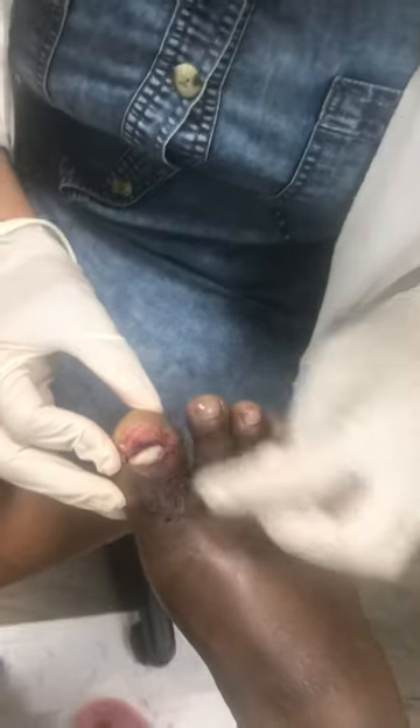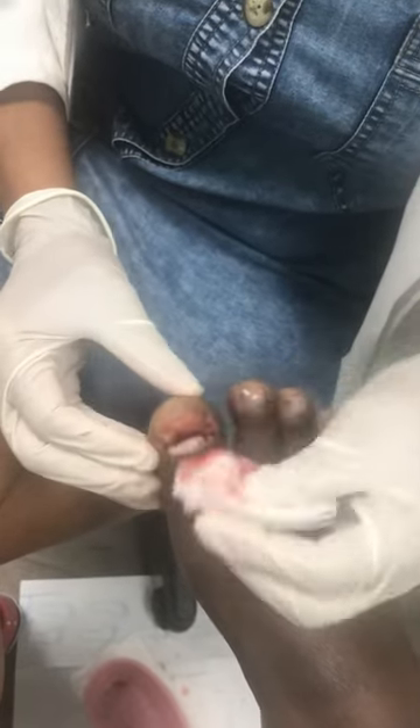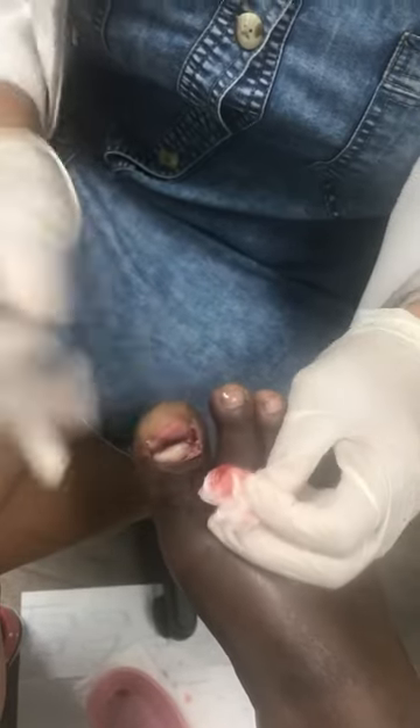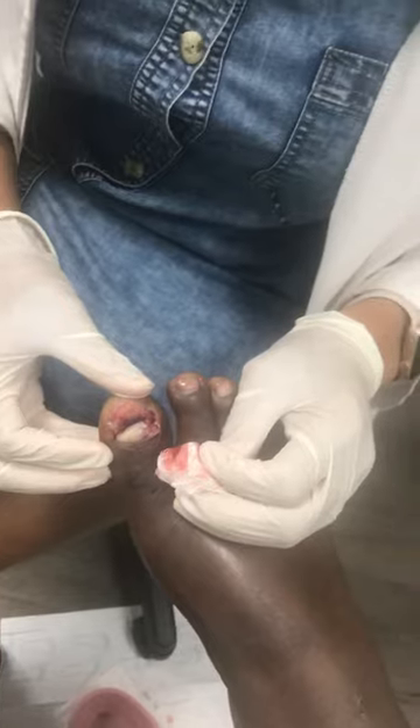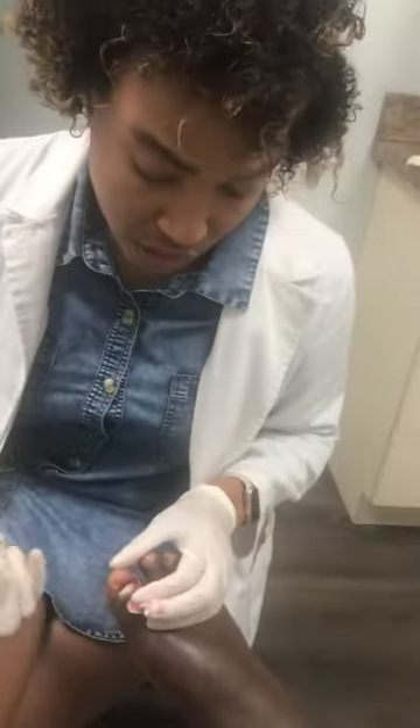He does have a little laceration under it, as you can see. So what I'm going to do now — which will probably not be on video — is suture the laceration to make sure that the bone is protected from any infection.